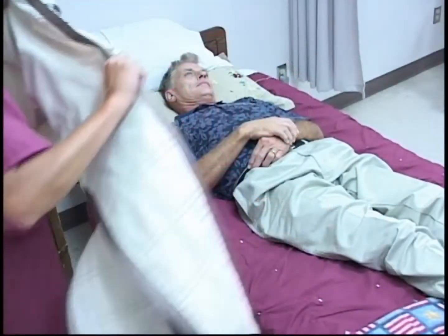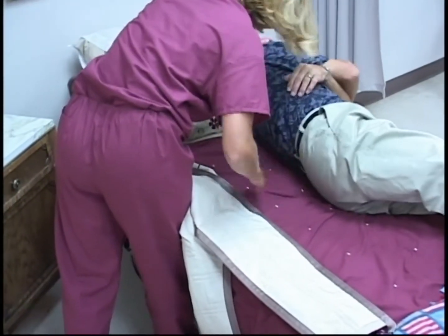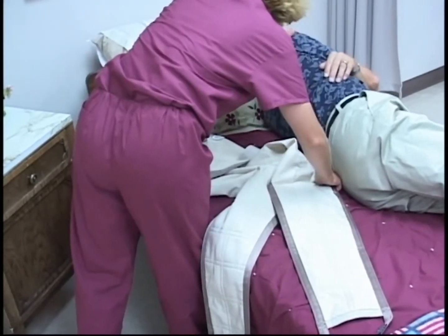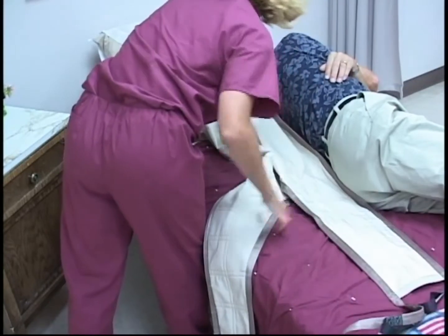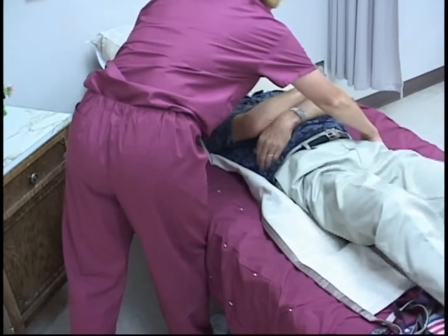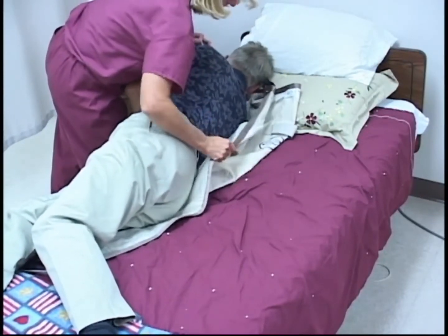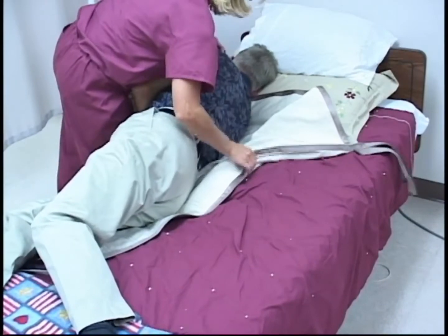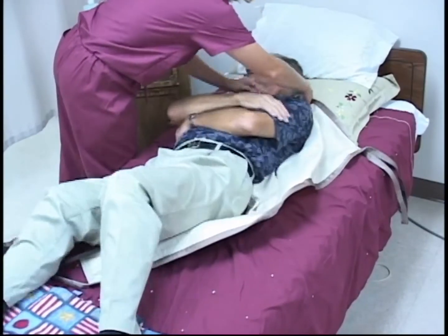Log roll the patient on their side away from you. Position the sling so that the handles and logo are facing the mattress. Tuck half of the sling under the patient. Center the sling on the patient's spine with the top of the opening of the sling even with the base of their tailbone. Roll the patient toward you and pull the rest of the sling out the other side.